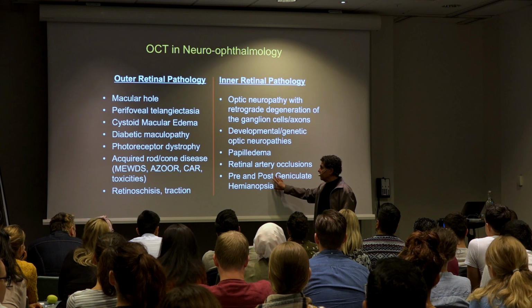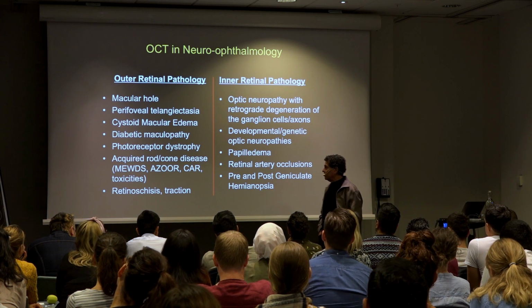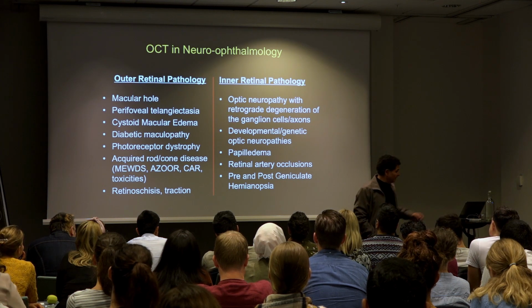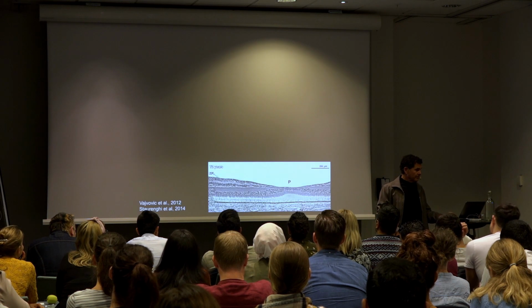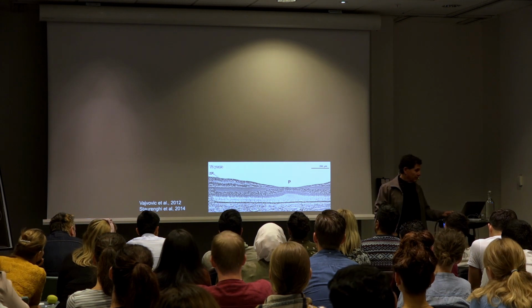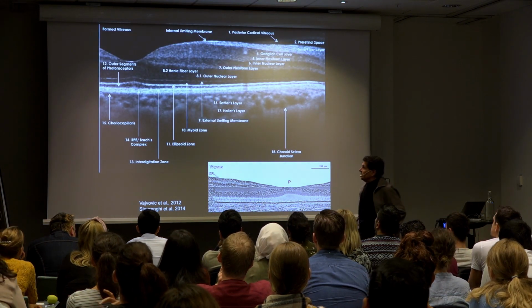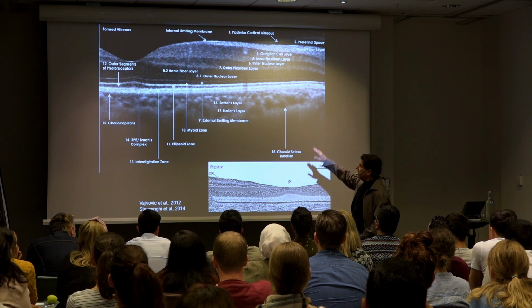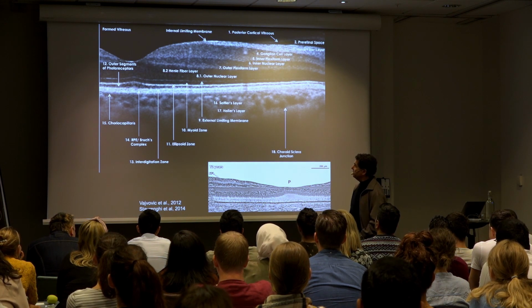And then we're going to talk about hemianopsias that are both pre and post geniculate, and how that affects the OCT. So that's kind of an overview. Most of you know the anatomy. Just as a quick review, I've shown a histology slide and a high-resolution OCT.